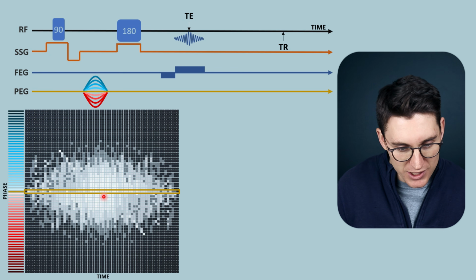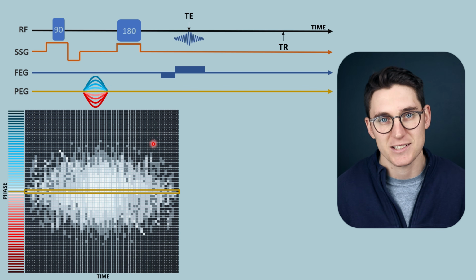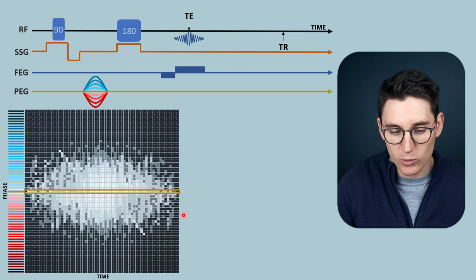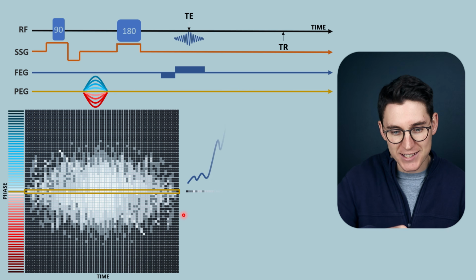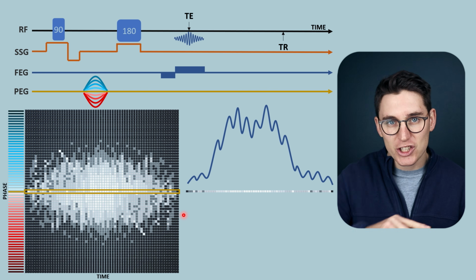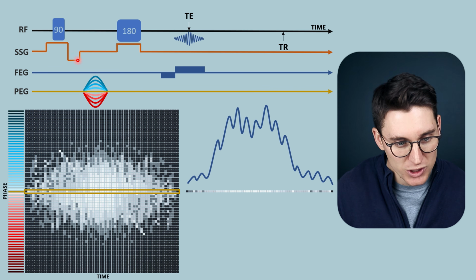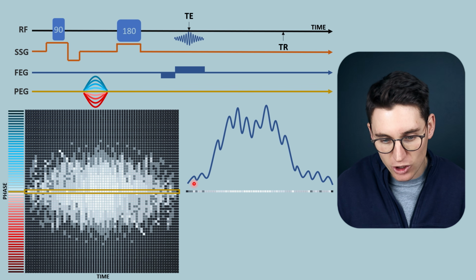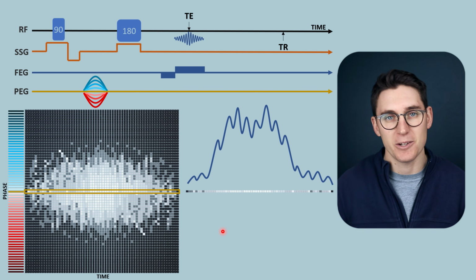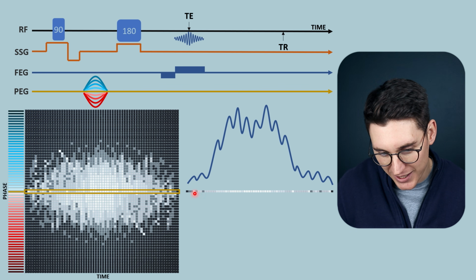Now let's use this line where we're not applying any phase encoding gradients along the y-axis direction. We know that we can sample the entire slice and measure that net magnetization vector over time. That change in net magnetization vector from the entire slice that we've selected using our slice selection gradient is going to give us an analog signal here, a continuous signal that's changing over a period of time.